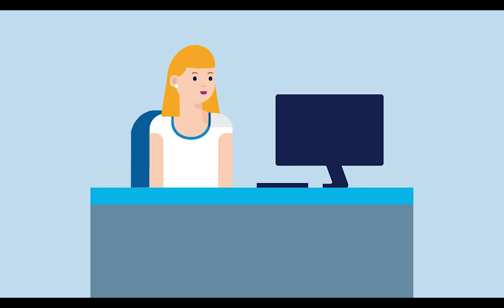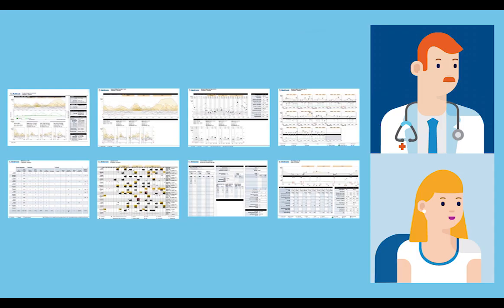Uploading your device data to the CareLink Personal website helps you understand more about your diabetes management and allows you to share your data with your healthcare professional.